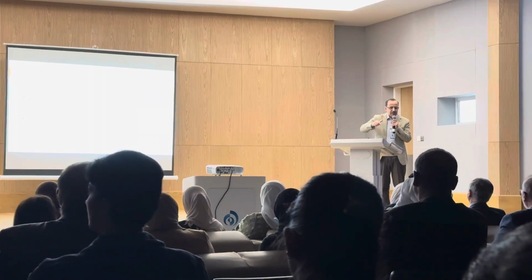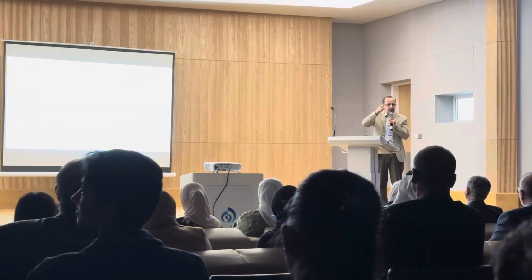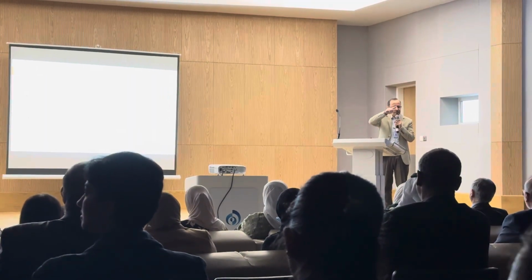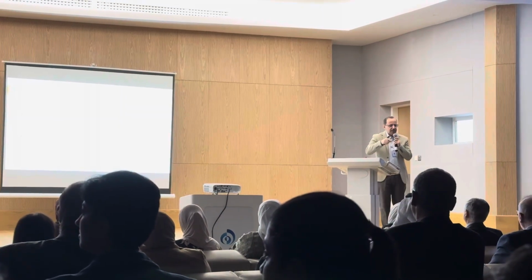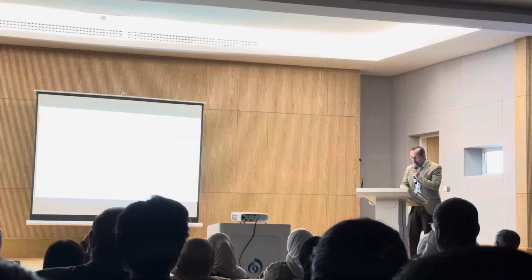The gantry which surrounds the patient table and the bore of the magnet is filled with this material, which will act as a superconductive magnet, which is a static and constant magnet. This is a brief idea about the principle.